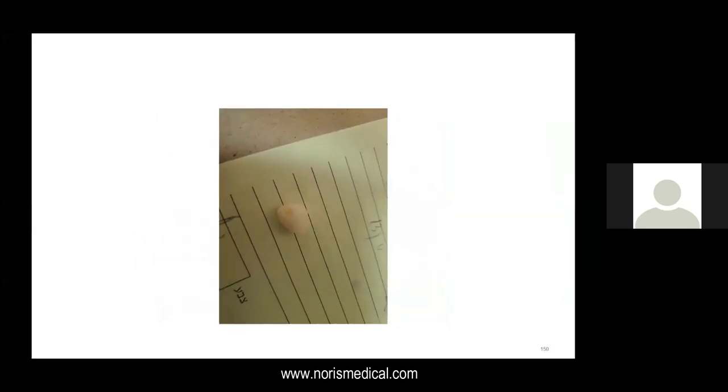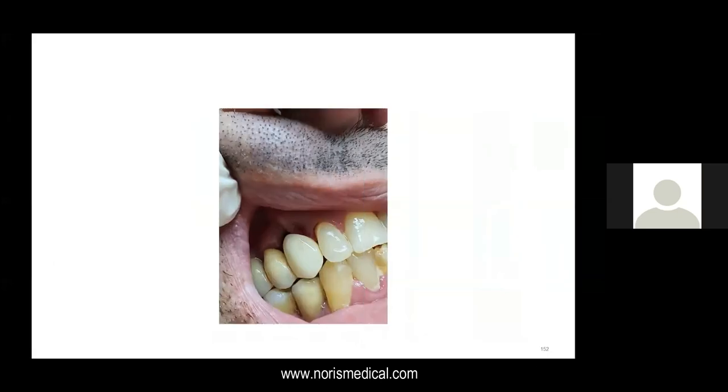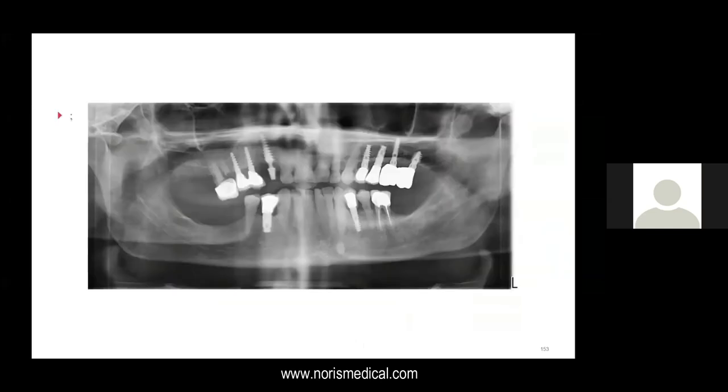This is the crown. This is how it comes. That's it. No plaster, no more heavy bags. And this is how it looks. It goes in, it clicks. Sometimes, because I don't touch the implant, even cement is almost unnecessary. So this is the final result after an hour, and the patient is really happy with that. So this is how the implant looks.